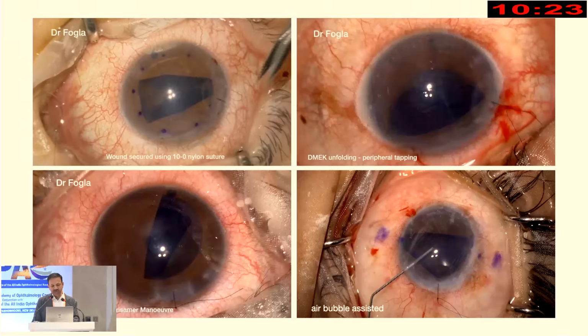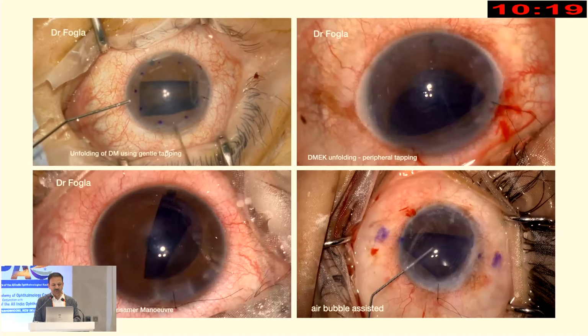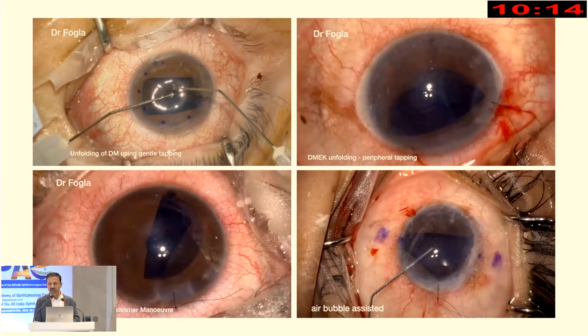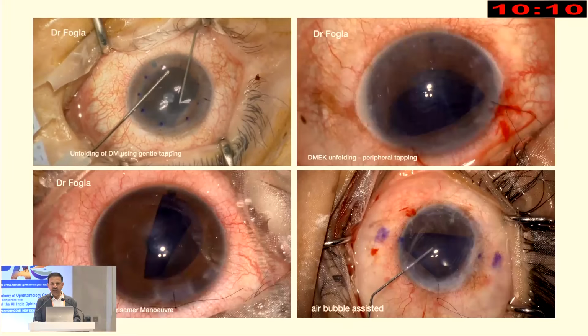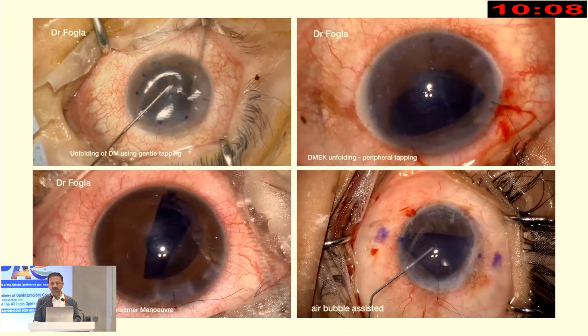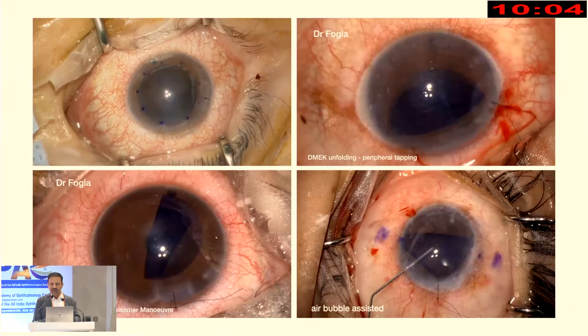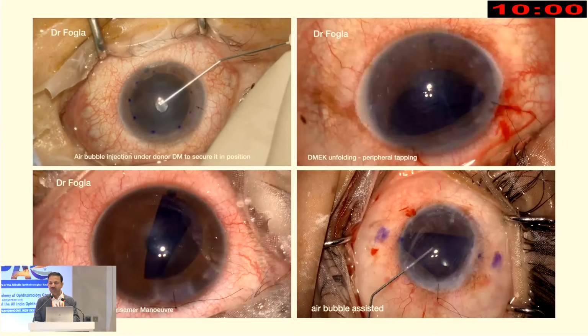When you have that open, single scroll on top, you secure the wound first, because while tapping you don't want fluid to get out of the main wound and the donor tissue to go out. So secure the wound and then keep the AC slightly shallow. I use two cannulas, one cannula to fixate one edge of the donor and the other one to tap either inside, outside, or you release fluid from the side port. These are the three basic mechanisms.